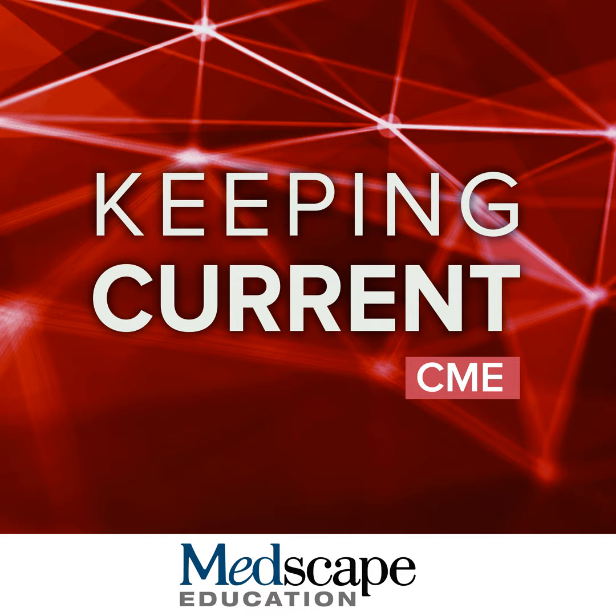We use it clinically, but there hasn't really been conclusive proof through multi-center studies. Hepatobiliary phase abbreviated MRI performs as well as full gadoxetic acid enhanced MRI for colorectal metastatic disease, and also with that, further studies are needed. And I thank you.